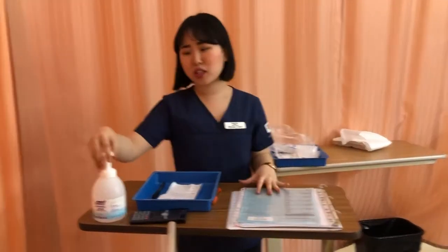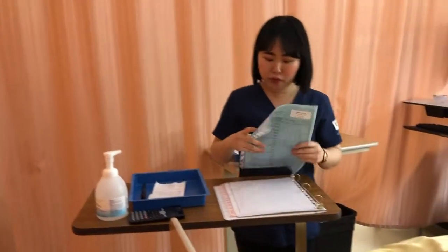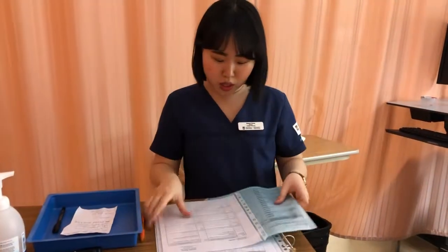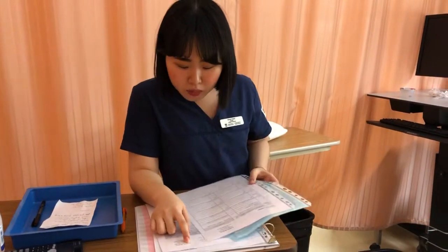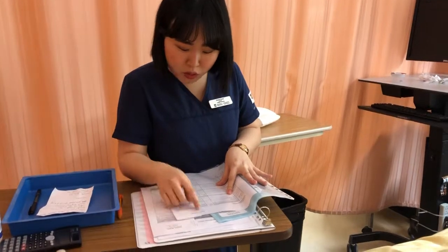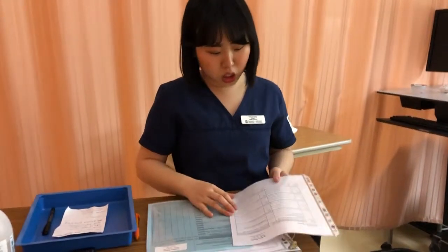I'm going to demonstrate the insulin administration and the chest tube. So I'm going to start with hand hygiene, and I'm going to do my first check with the order and the patient administration record. So I check the same name, Scotlan Bryson, and FIN number is right, same FIN number. And I'm going to check the first medication check.